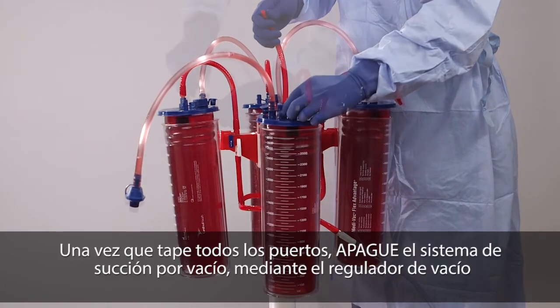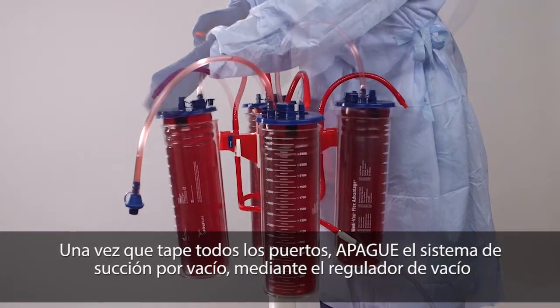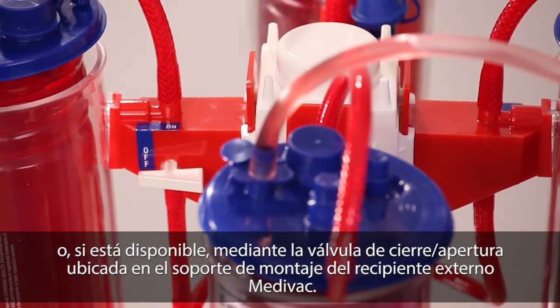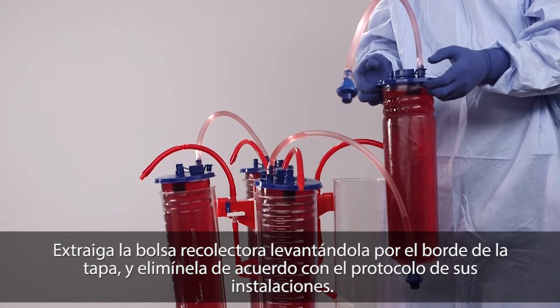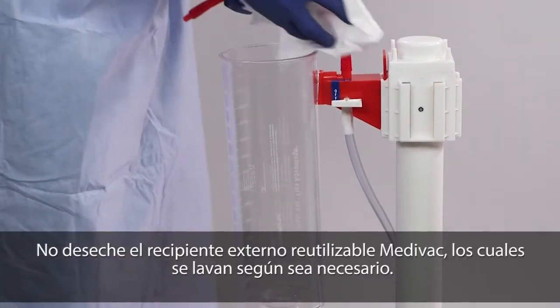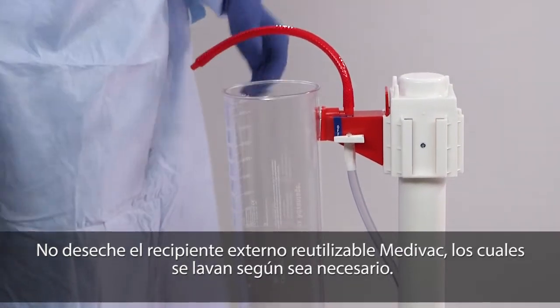Once all ports are capped, turn vacuum suction off using either the vacuum regulator or, if provided, the on-off valve located on the bracket of the reusable outer canister. Remove liners by lifting upward on the rim of the lid and dispose of in compliance with your facility's protocol. Do not discard the reusable outer canisters. Canisters may be cleaned as needed.